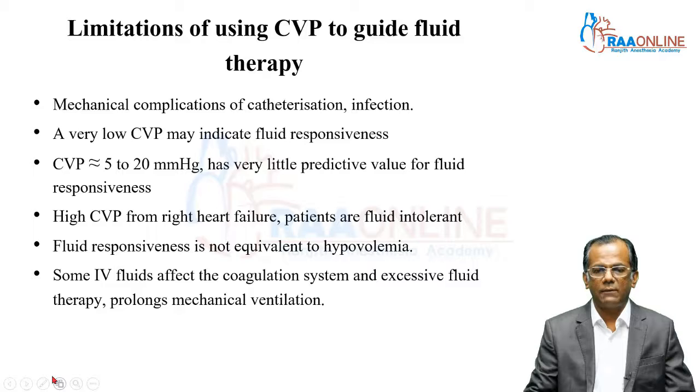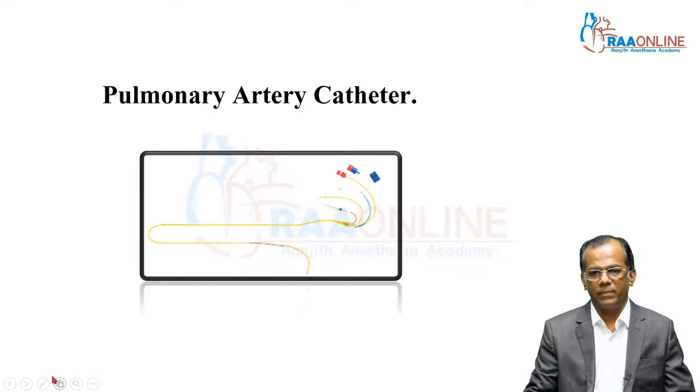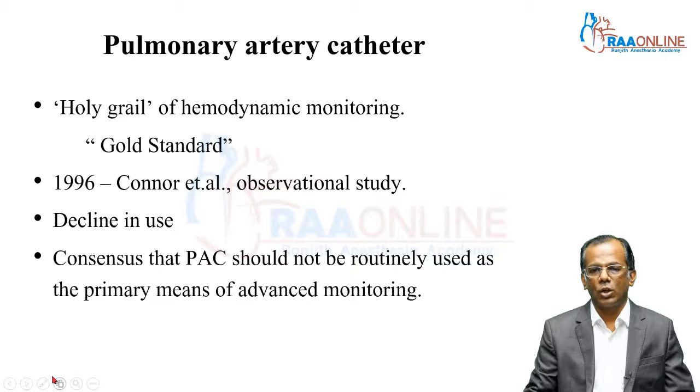You have to know that fluid responsiveness does not mean that this patient is hypovolemic. And some IV fluids do affect the coagulation system, and excessive fluid therapy can prolong mechanical ventilation. Now, coming to the pulmonary artery catheter. This was the gold standard of hemodynamic monitoring.